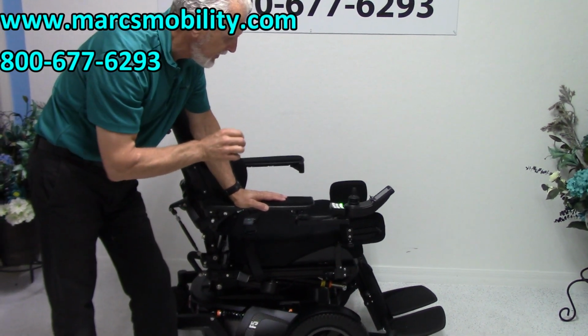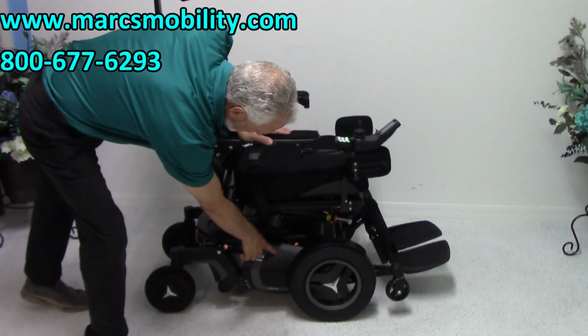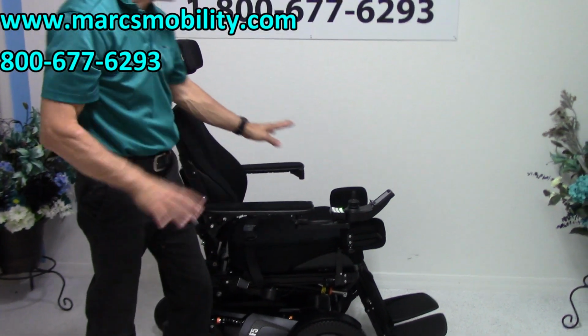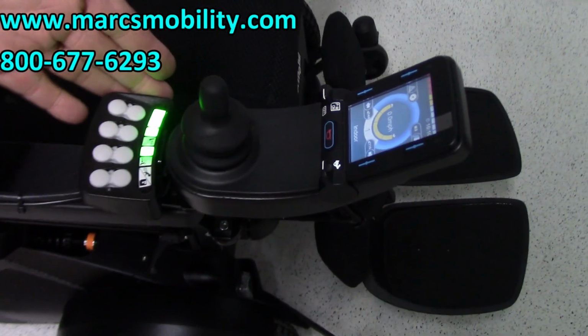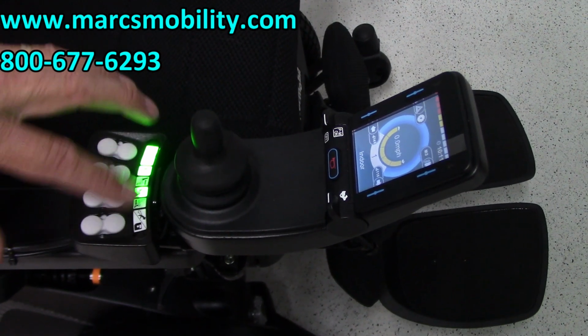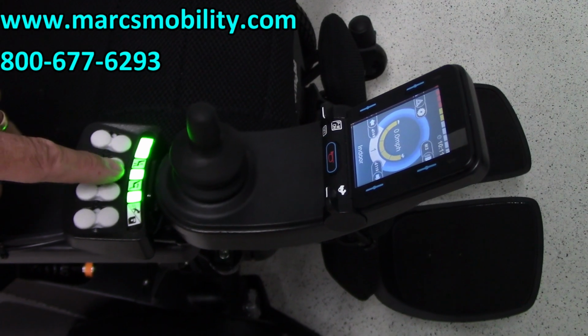So this is the Permobil F5 VS charcoal black color. That's the color of the chair. All the functions can be worked through the joystick or through the switch box. I like to use the switch box. So if you want to switch from these 3 functions here to the next 3, you just hit the button right here. It'll switch the next function, the next 2.